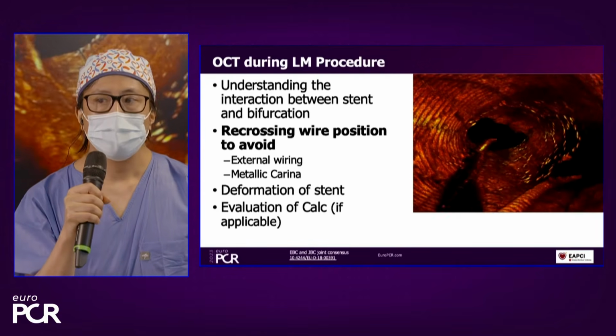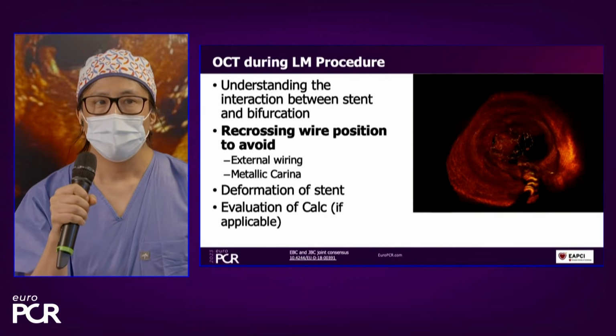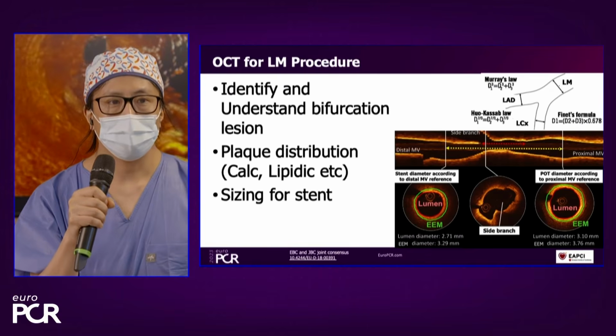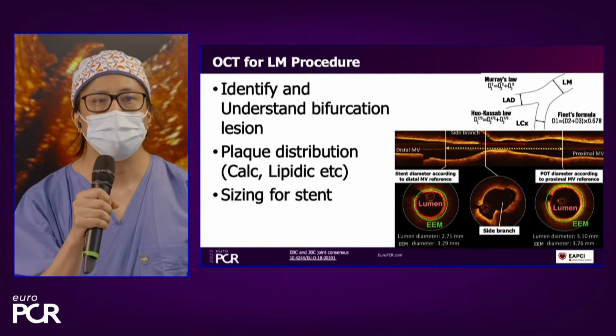To go back to the last slide, if you can. So there have been a number of questions, and it may be a good opportunity if we just go back to the last slide. You've measured lumen. Is there a role for measuring external elastic membrane?